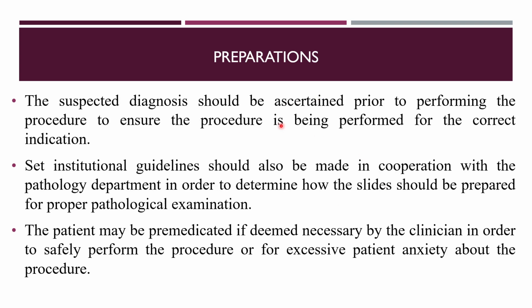So, for the preparation, first of all, the patient should be informed beforehand about the procedure, and all the institutional guidance should be clear to the patient. If their relatives, parents, or guardians are there, they also should be aware of this before going into the procedure. And the clinician should have informed the patient of all these safety concerns.